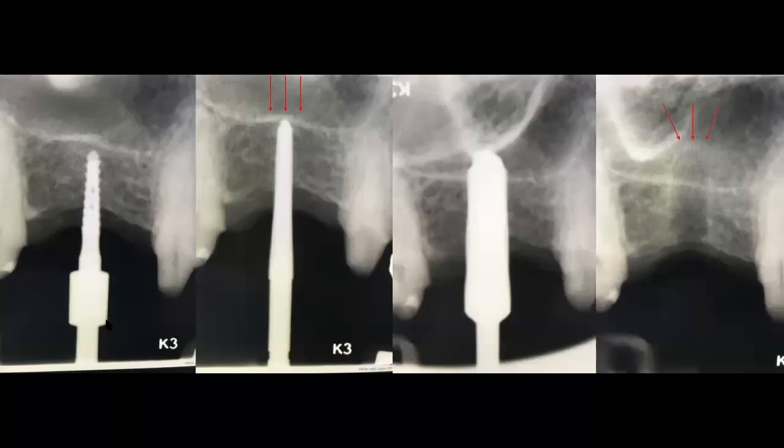So what you see on the left-hand side is that pilot drill right in the center of the temporary, dead center, and I went through that little hole access that you saw that I fabricated on the temporary. I'm going to stay a little bit back. You can see that I'm maybe a millimeter or 2 away from the sinus floor. Then I'm going to use the actual pilot drill going forward at 800 to 1200 RPM. This is the pilot drill that comes in the Versa drill kit.